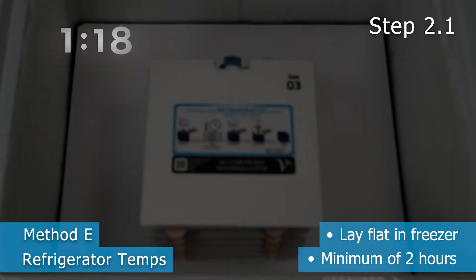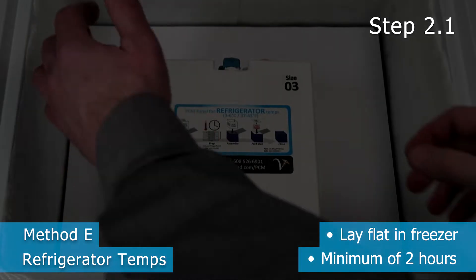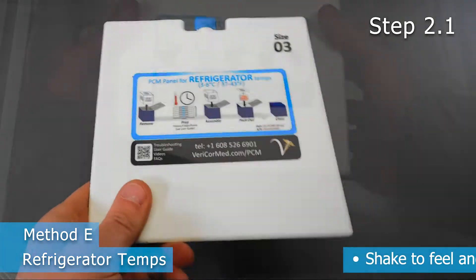In a standard freezer, this generally takes around 2 hours. Please note that the panels can be stored in a freezer indefinitely. The important thing is to get the liquid to turn solid.